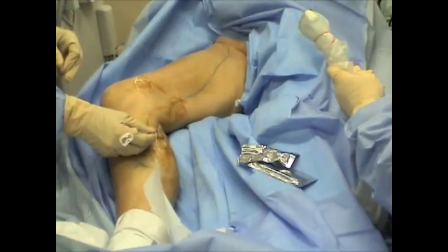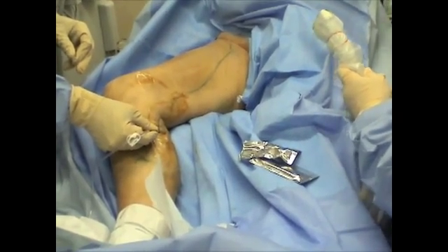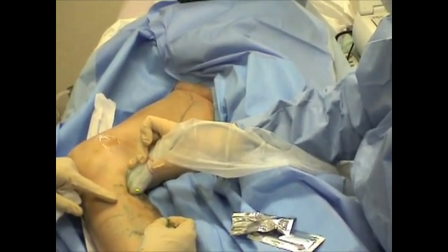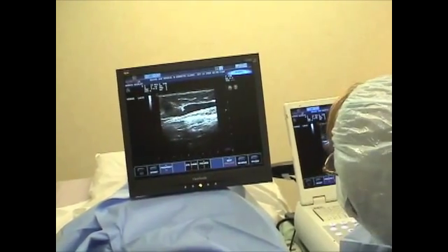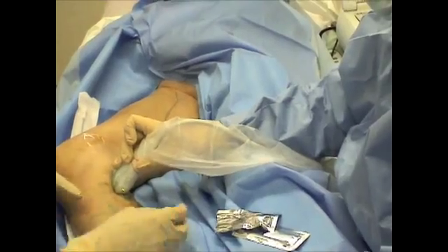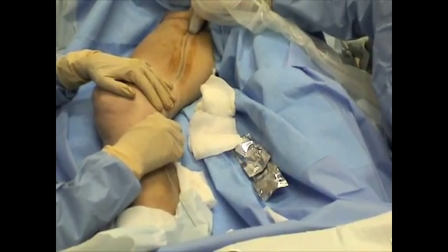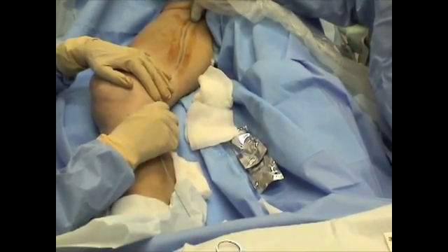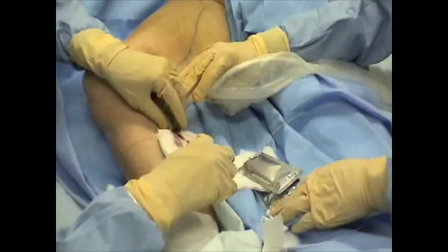A small needle is placed inside the varicose vein under ultrasound guidance. The progress of the needle may be watched on the screen. A guide wire is inserted through the needle, a cannula is inserted over the guide wire, and then the guide wire is removed.